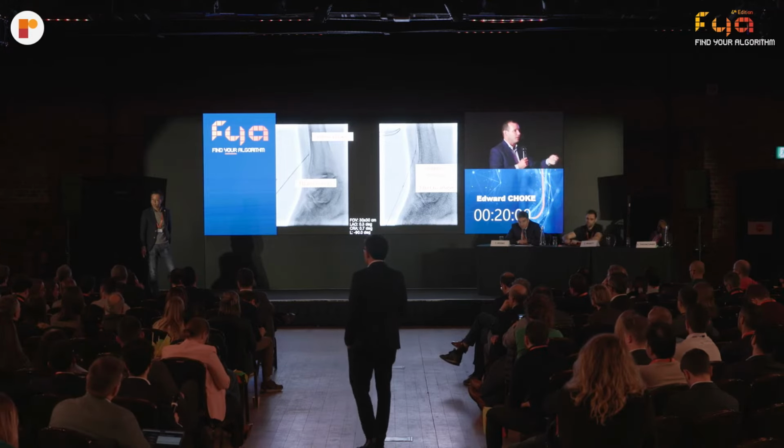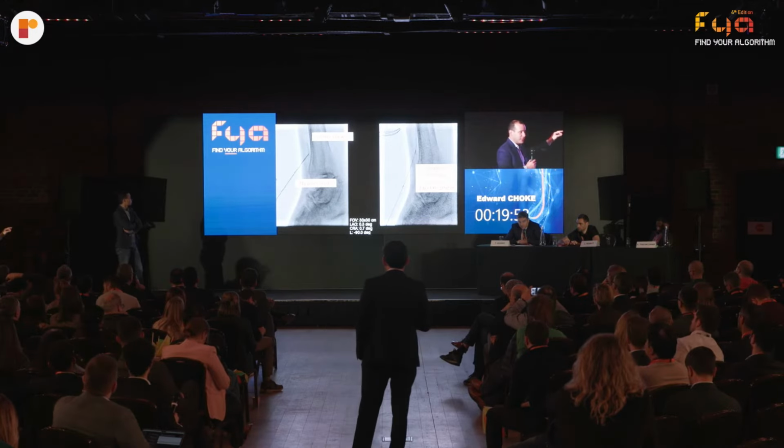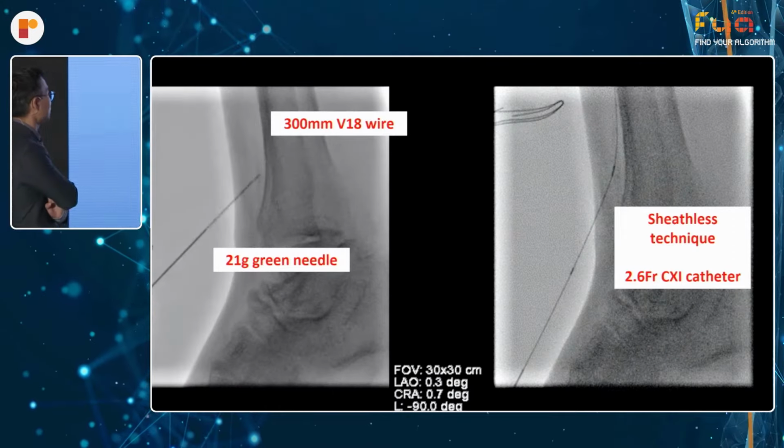So you can go with the micro knuckle, in my experience, as soon as you find that the distal target you are just dissecting. This is where the bypass then won't be possible because you dissected the whole vessel, and this is where you really risk destroying the foot and the foot arch. So I think it's really important if you're dealing with CLTI, really be comfortable with retrograde punctures.